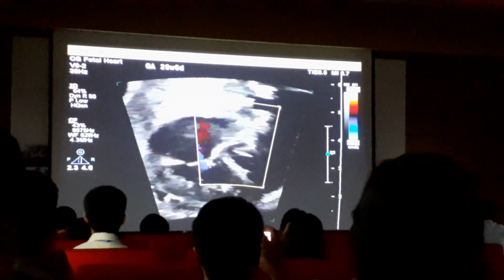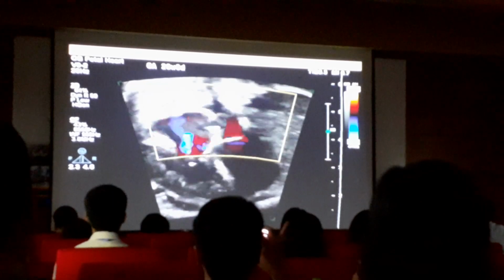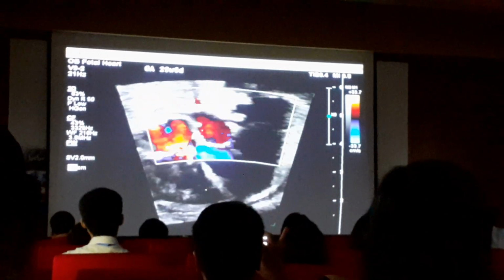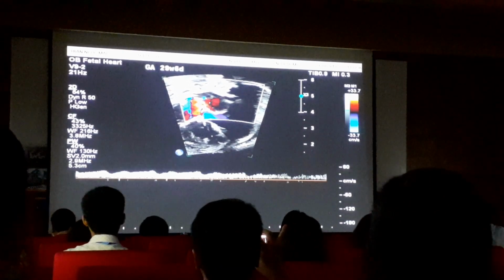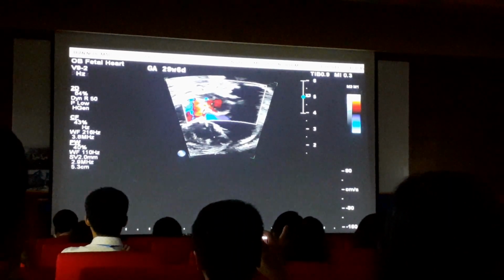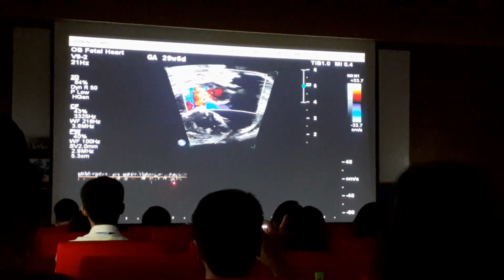Okay, there's no mitral regurgitation. I also want to sample the pulmonary veins. Again, it's helpful to have an algorithm in your head, a system, and never skip things because you're distracted. Pulmonary vein Doppler looks normal. That's better. If the sweep is too long it looks abnormal, but if we slow the sweep down we see it is normal.